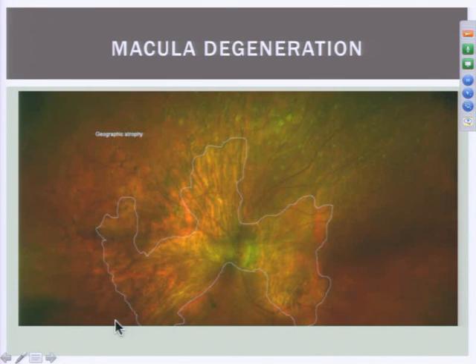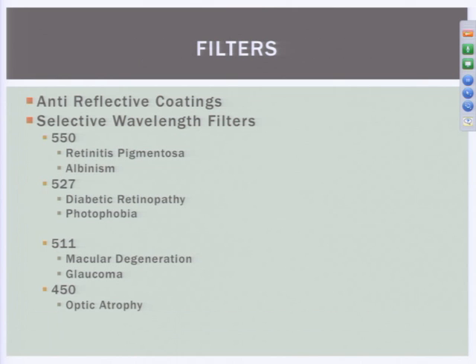So in macular degeneration, we use prisms to move the images away from the dead zone onto the sighted zone, and then it requires a lot of training, or what we call rehabilitation, to keep people staying out here and using this vision, because their natural tendency is to go back to their old pattern of vision and use the macula. So prisms are used sometimes only in the testing and rehabilitation, and sometimes we actually grind the prism lenses right into their low vision glasses.